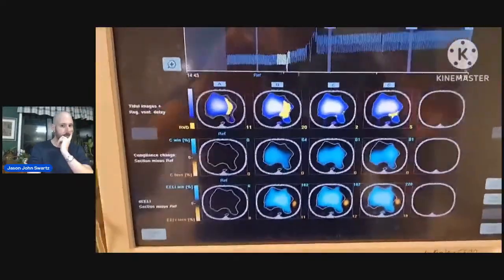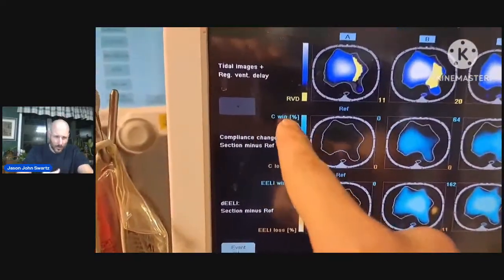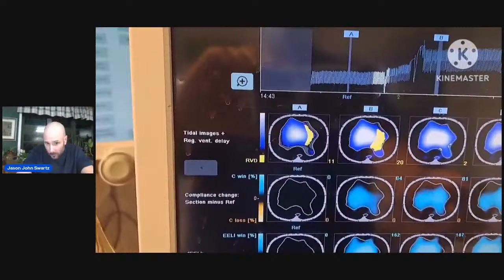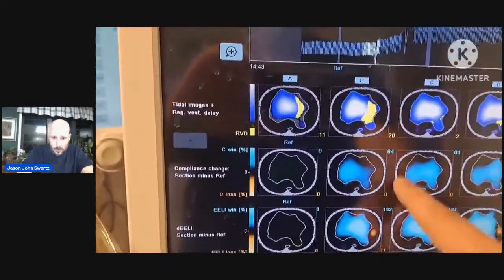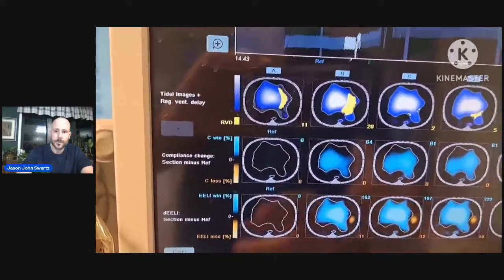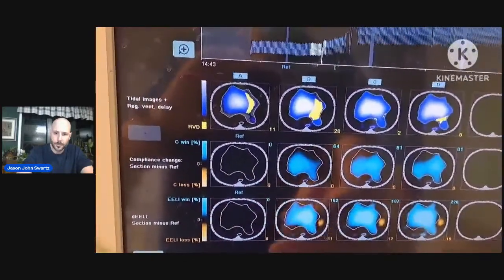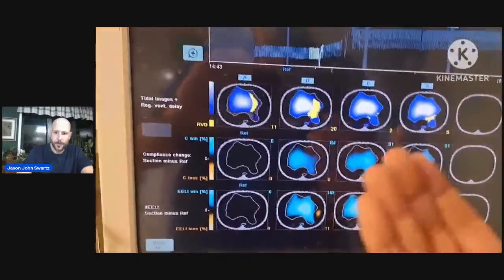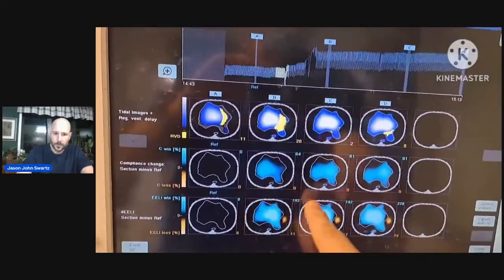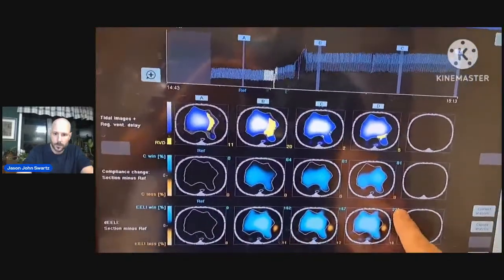Then after, that's recruitable. So you see compliance win percentage. We won 64, 81, 81%. And it's well distributed everywhere. All that blue is a compliance win in all those areas, showing that the patient has an extremely high recruitability percentage, 162. And we're just keeping it. And look, it's recruiting 187, 220.